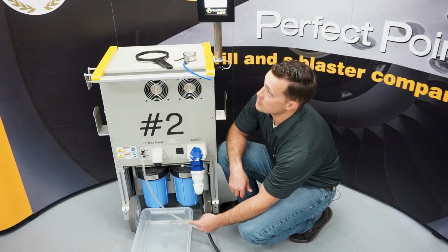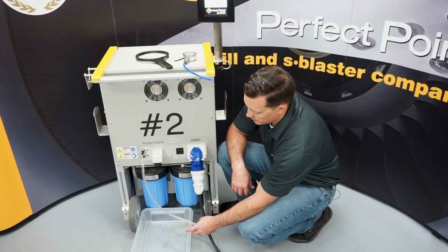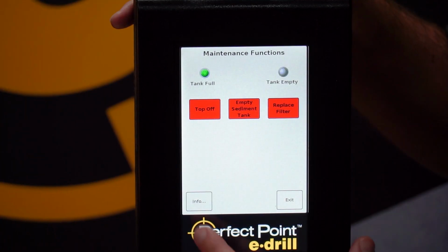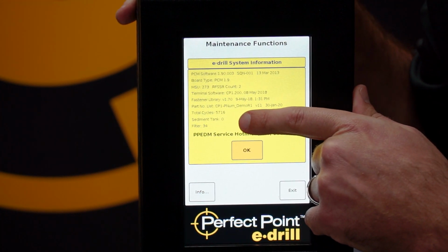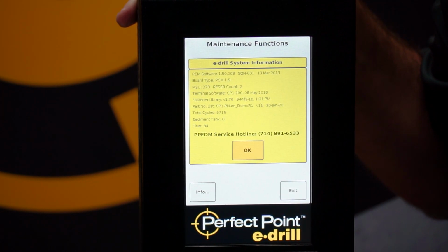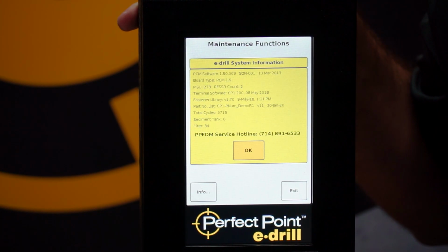Once the pump stops, we ensure the system is full. We can verify that we did in fact reset that counter by coming up to the touchscreen display, hitting info, and seeing on sediment tank, it reads 0. So we told the machine, we cleaned out that sediment tank, and we got 1,500 cuts before we need to do it again.